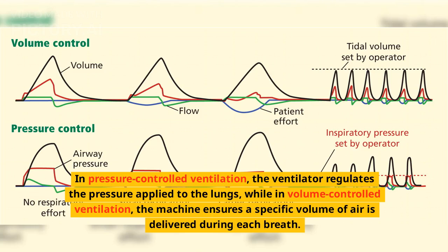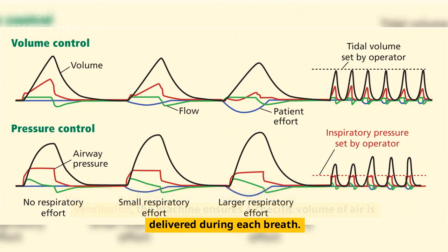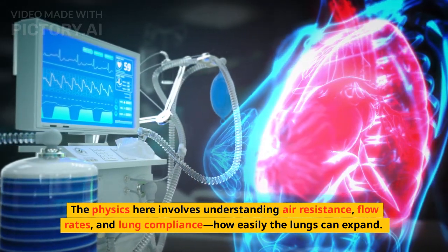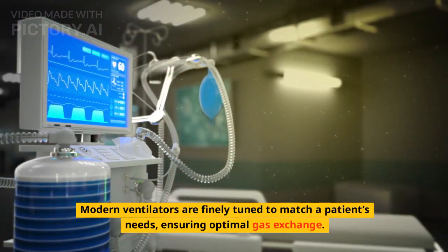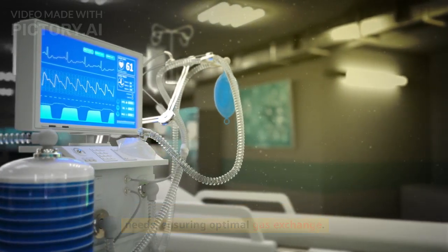In pressure-controlled ventilation, the ventilator regulates the pressure applied to the lungs, while in volume-controlled ventilation, the machine ensures a specific volume of air is delivered during each breath. The physics here involves understanding air resistance, flow rates, and lung compliance, how easily the lungs can expand. Modern ventilators are finely tuned to match a patient's needs, ensuring optimal gas exchange.